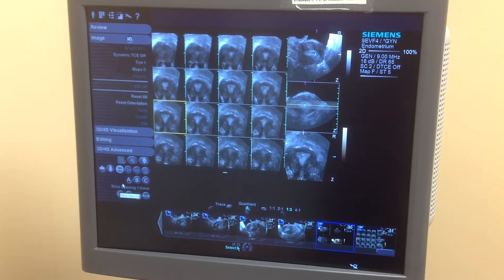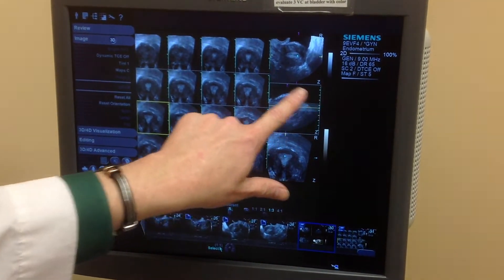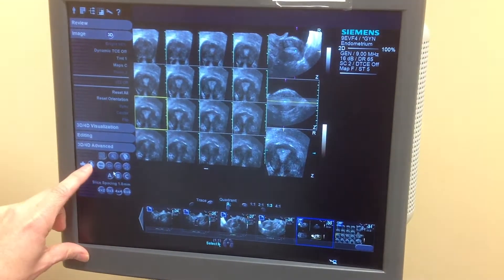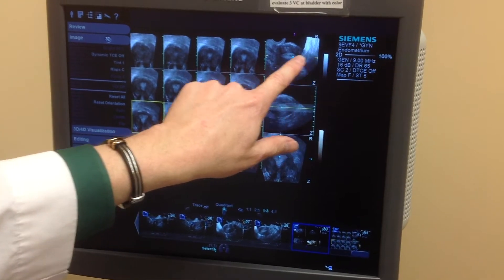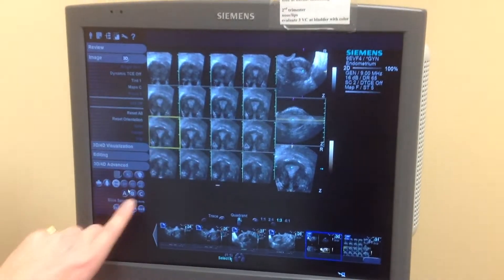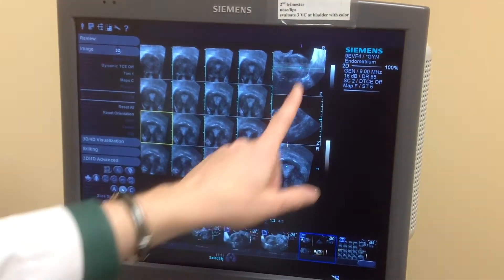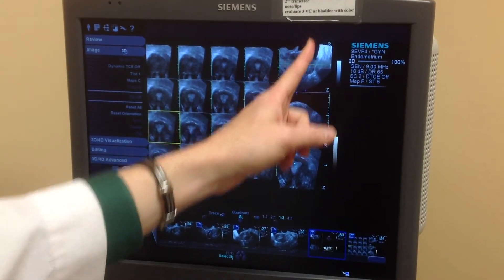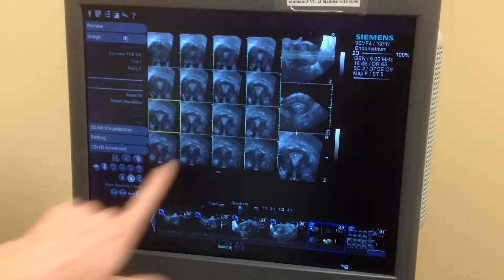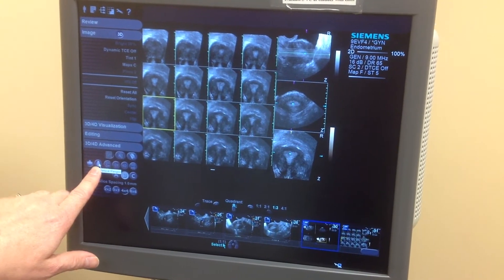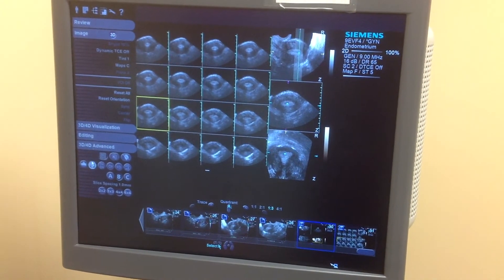In this particular view it's A, B, C. Slicing the A plane horizontally gives you the coronal image — slicing through B horizontally gives the same particular view, so switching from A to B here won't change those images. If you want to see the transverse images, go to the B plane and slice it vertically — that gives you transverse images. Leaving this on B but changing to vertical slices, you'll see the transverse images pop up.